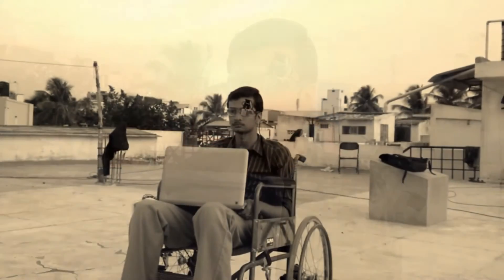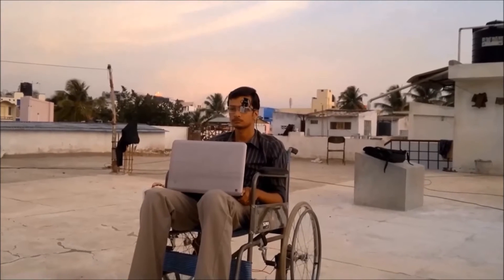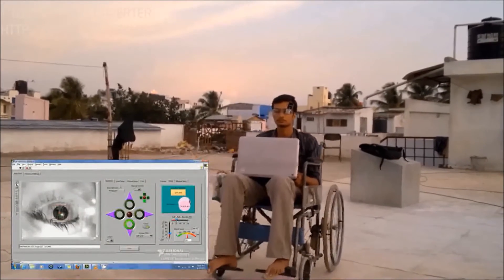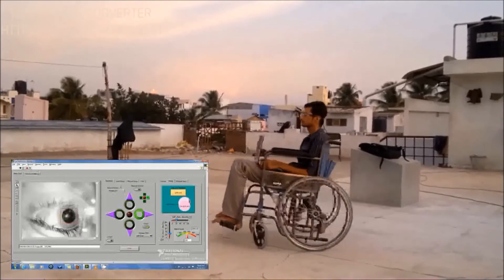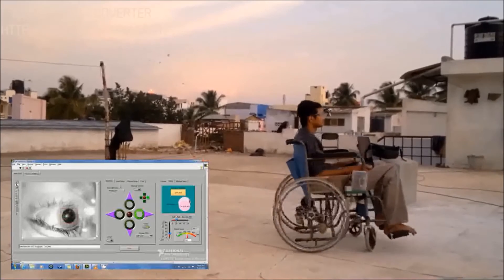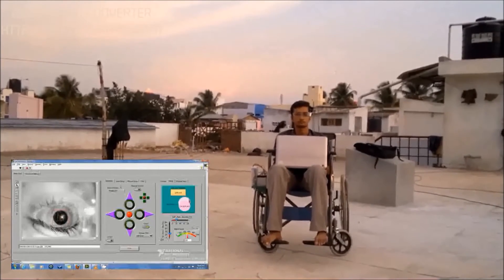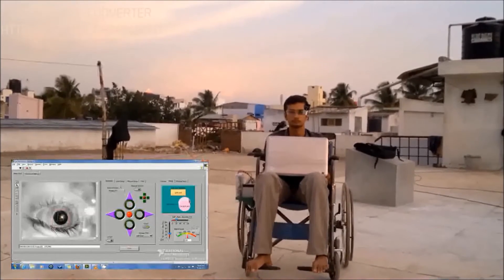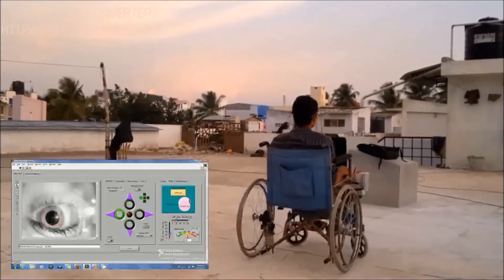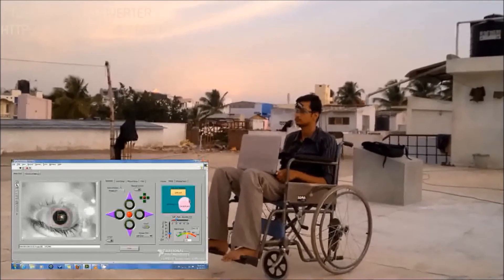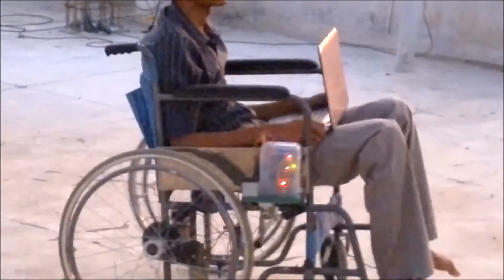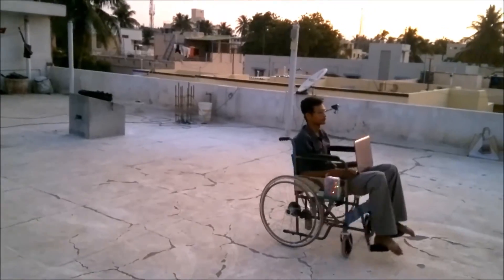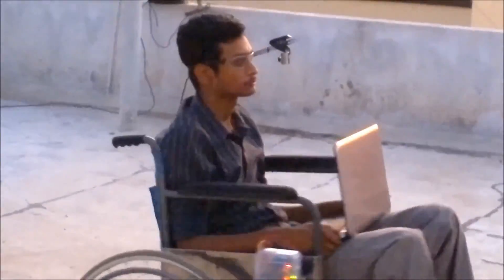Now let's watch the demo of our prototype. When the patient looks down, the wheelchair moves backwards. Similarly, looking right makes the wheelchair turn right. Now the patient is looking up, and now left. In this way, paralyzed patients can move around the house by just using their eye movements, making them independent and eliminating the need for a caregiver.